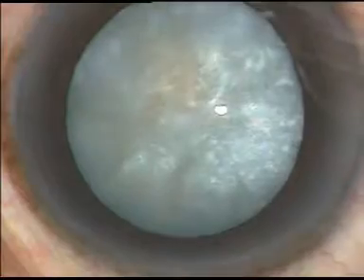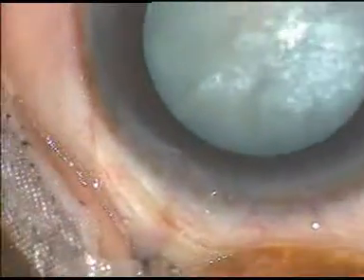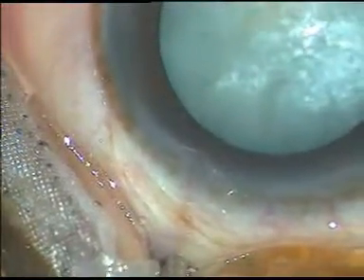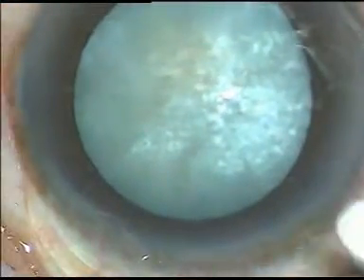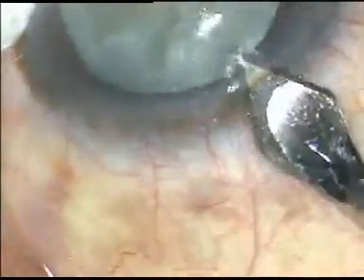This is an intumescent cataract. The main incision is being given at around 11 o'clock. This is a complete unedited surgery. Here it goes at around 11:30 o'clock. The main incision is given.